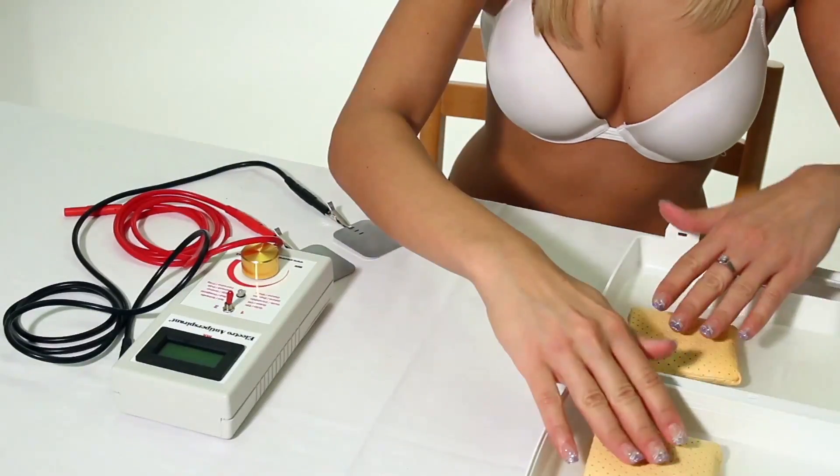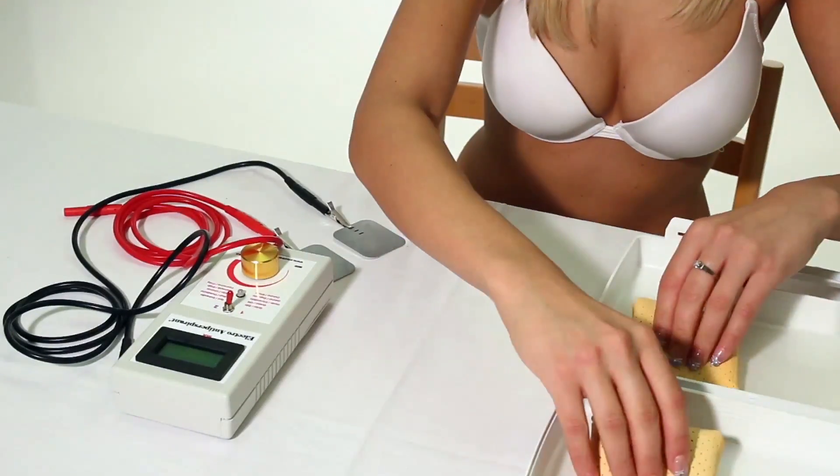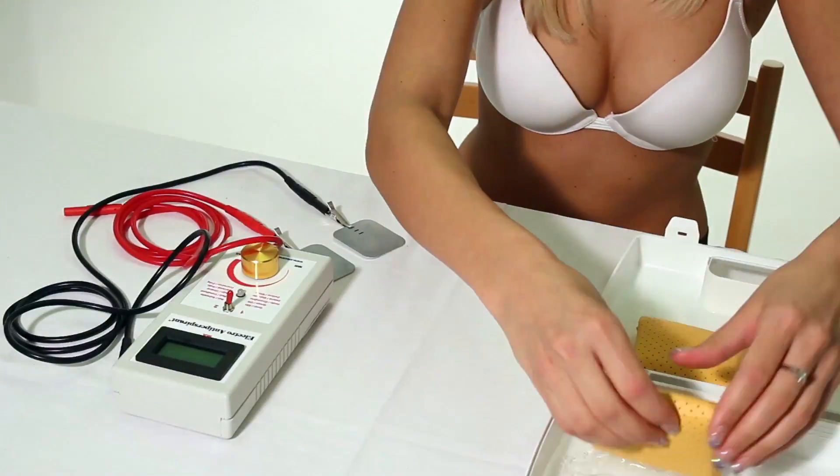Then immerse each adapter into tap, preferably warm, water. Let it absorb as much water as possible and wring it gently.